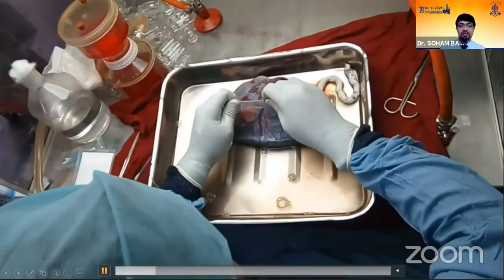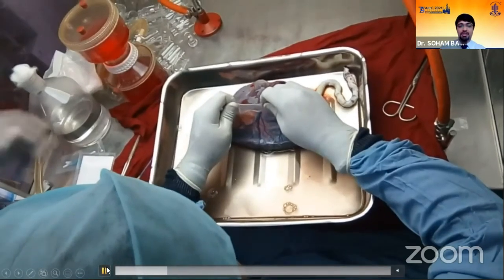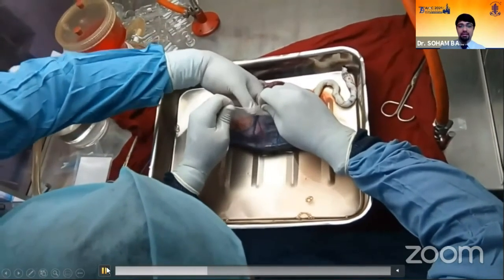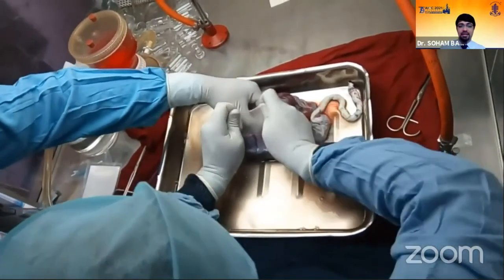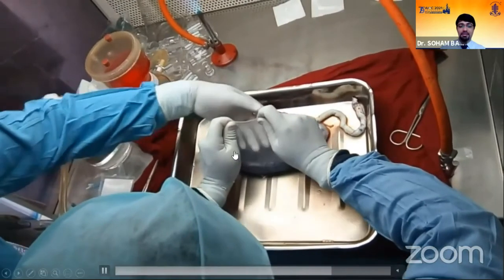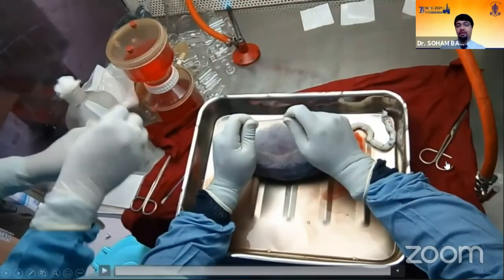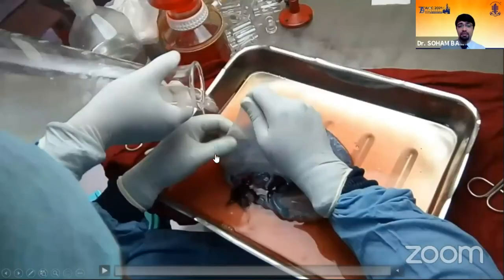Once it is cleaned, it's time to harvest. Usually we get one of these cleavage planes of the amnion. This is a separation between the amnion and chorion. Once that is done, the other person helps in gently peeling the surface. And here you can see the amnion is separated from the underlying chorionic tissue.